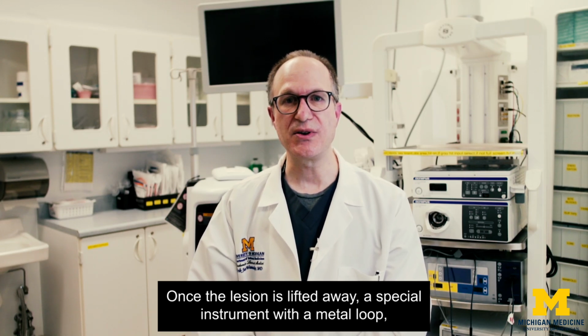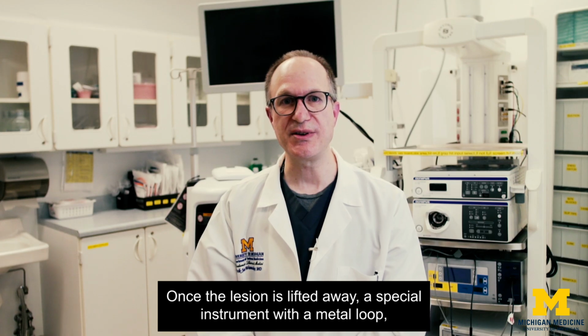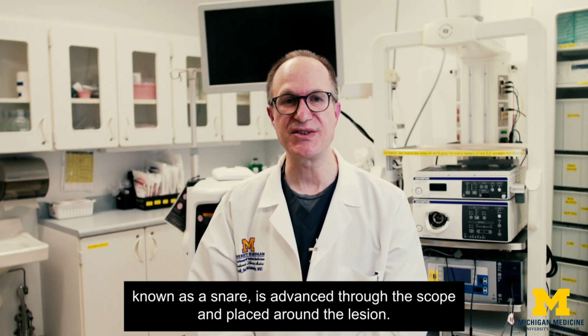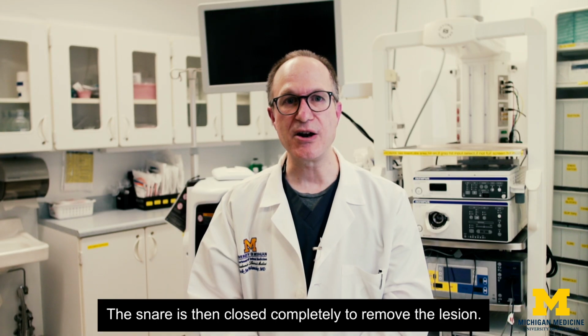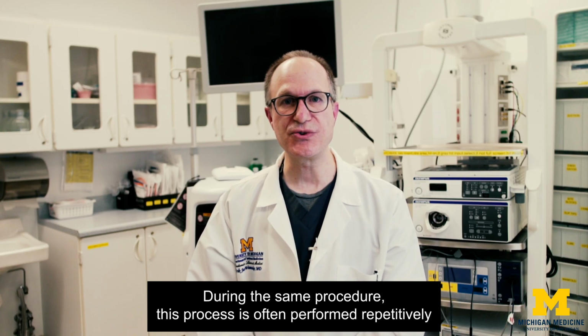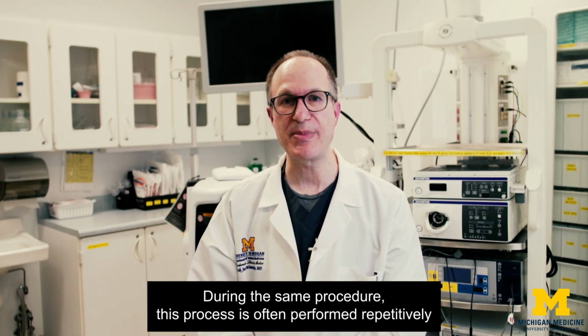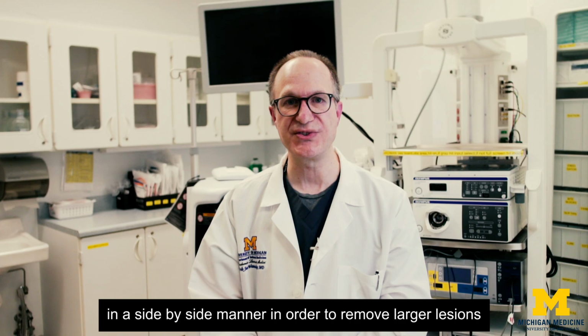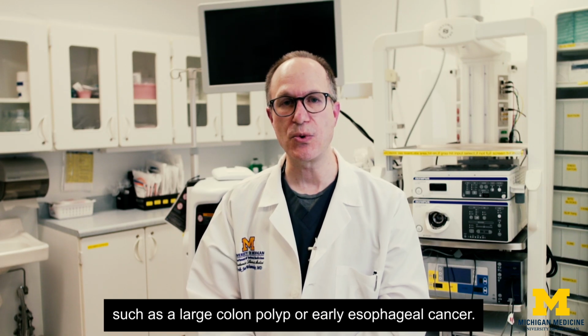Once the lesion is lifted away, a special instrument with a metal loop known as a snare is advanced through the scope and placed around the lesion. The snare is then closed completely to remove the lesion. During the same procedure, this process is often performed repetitively in a side-by-side manner in order to remove larger lesions such as a large colon polyp or early esophageal cancer.